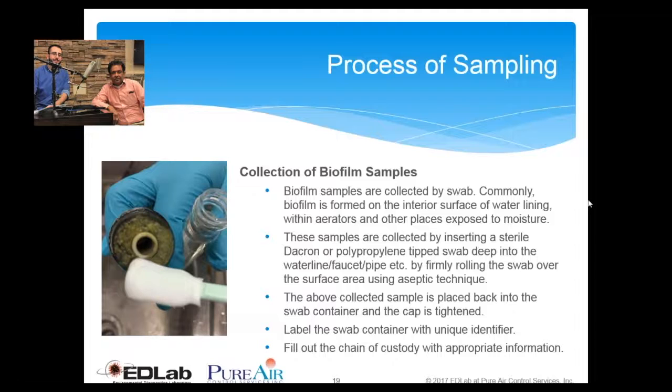If you open it, there is a washer and other parts between the water supply and the faucet head, and nobody typically pays a lot of attention to them during housekeeping. So slowly, if the water starts leaching a lot of organic material there, it is going to form a film with a lot of microbes in it. I'm not going into technical detail because it is a big class in itself. So biofilm is formed, and obviously this bacteria can also hide there.